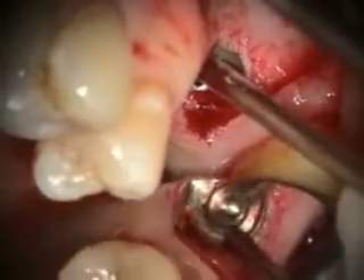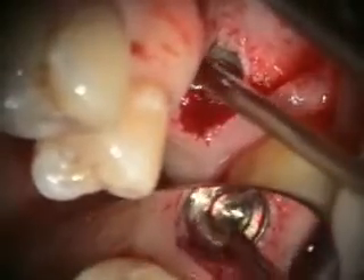You can see how the bone is profiled there, especially on the mesial. We'll put our healing button in there.